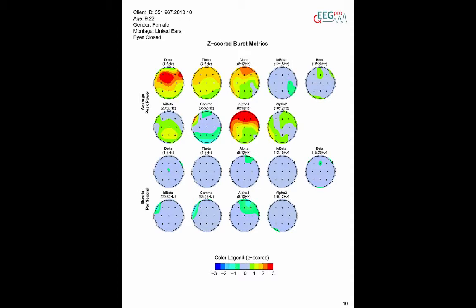In the current example, the average peak power of frontal alpha is very high, suggesting that the deviant average absolute power around 8 Hz at the frontal electrodes is caused by very strong bursts that are present in about 50% of the recording.